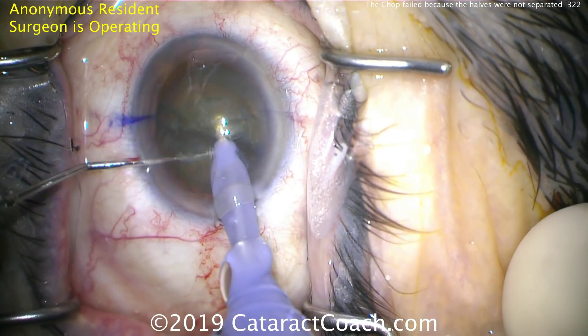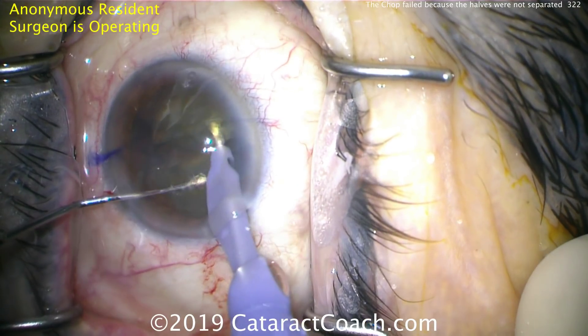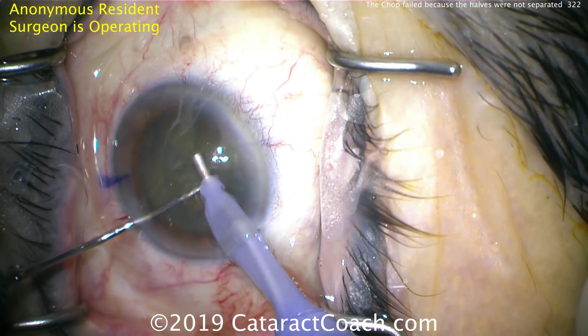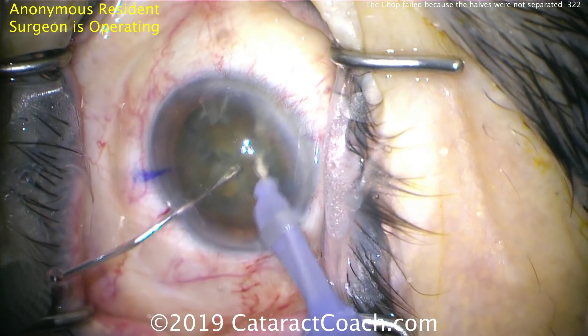You see the eye coming away from the primary position. The surgeon is not doing a great job of controlling eye position — the light reflex is not in the center of the cornea. The surgeon needs to re-center the eye — there you go, that's a little better.